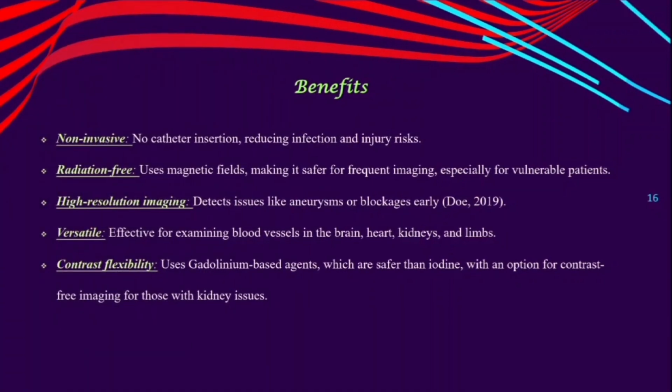Benefits. It is non-invasive, no catheter insertion, reducing infection and injury risks. It is radiation-free and uses magnetic fields, making it safer for frequent imaging, especially for vulnerable patients. High-resolution images. It detects issues like aneurysms or blockages early.